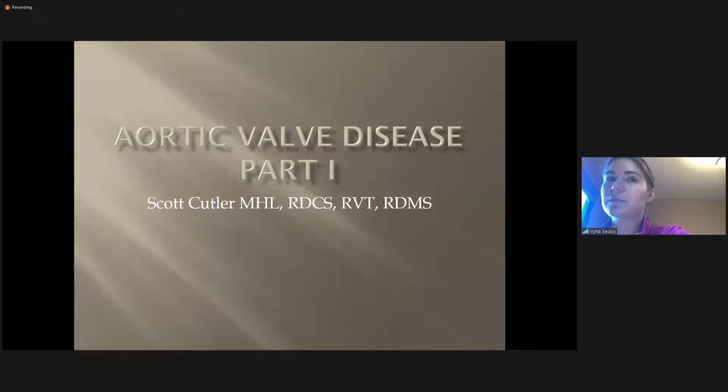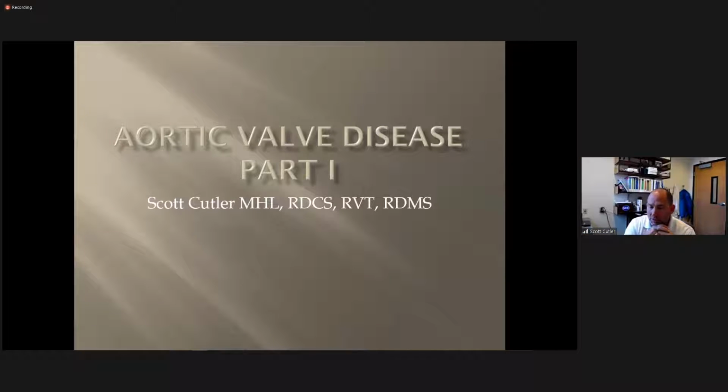Yeah, about this exam. Oh yeah, so the competency exam. The idea is that we have the critical thinking skills, meaning that we take the data that we're learning in this class and other classes, and we're applying it to what pictures we're taking in the lab. I'm a believer that just taking a picture that's parasternal long axis, for example, and making it look pretty doesn't mean it has the diagnostic characteristics that I need to show. So we need to recognize when we're taking that picture for this pathology or that pathology, whether it's proving that this is true or not true.